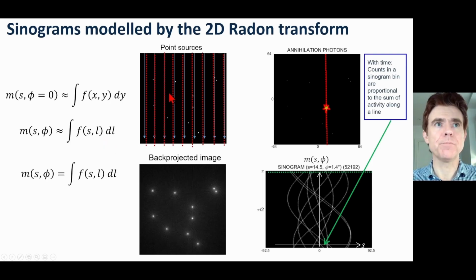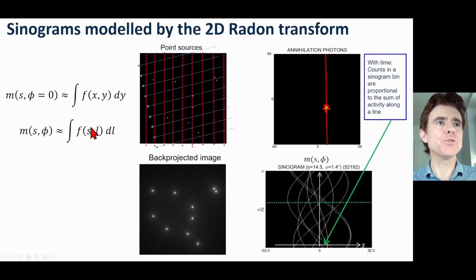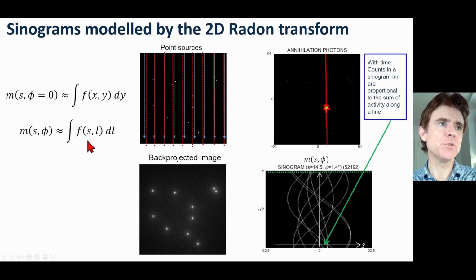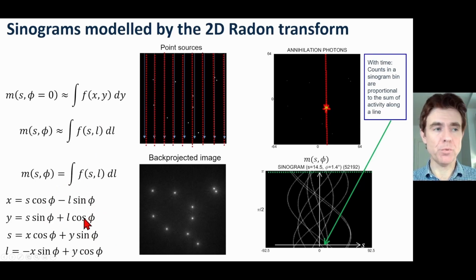Just like here, s of course was in this direction, and we're integrating in a perpendicular direction to that. And if you want to understand the connection between s, l and x, y, then we can just use these simple trigonometric equations here, which I'll let you examine in your own time.